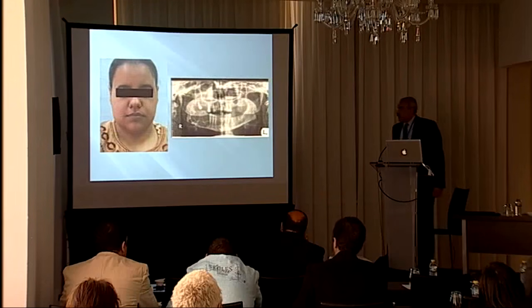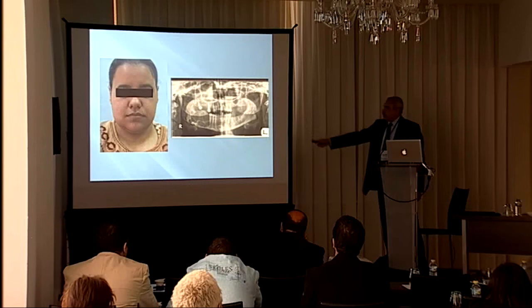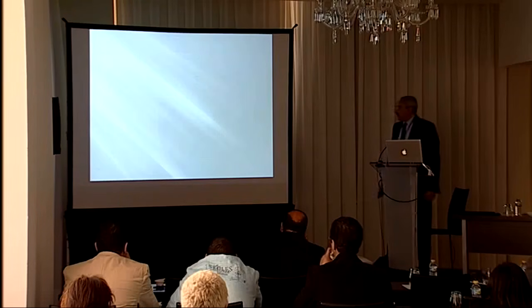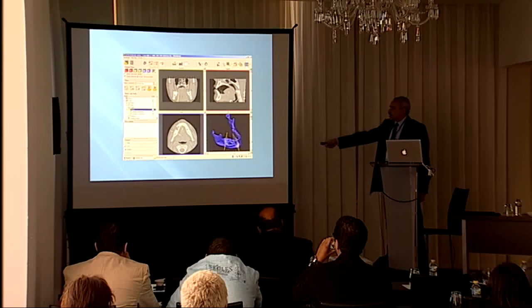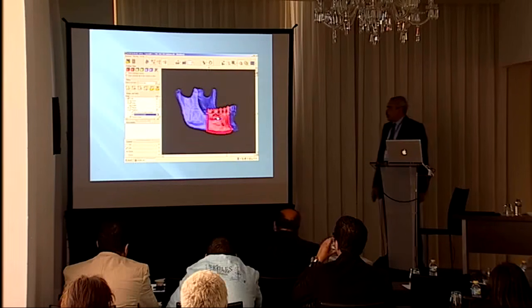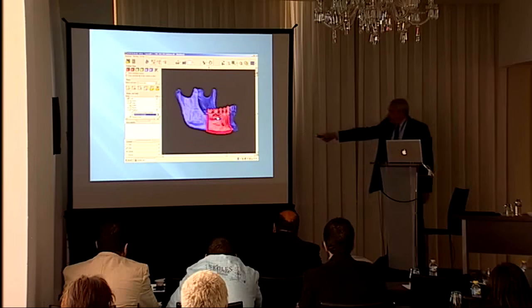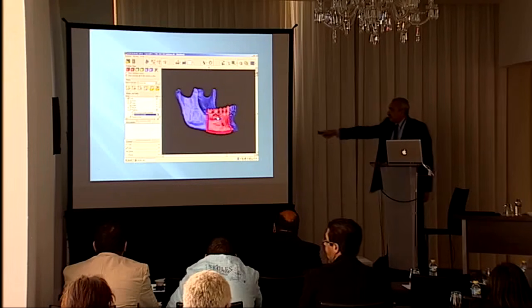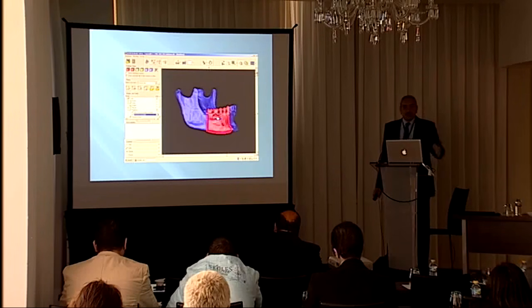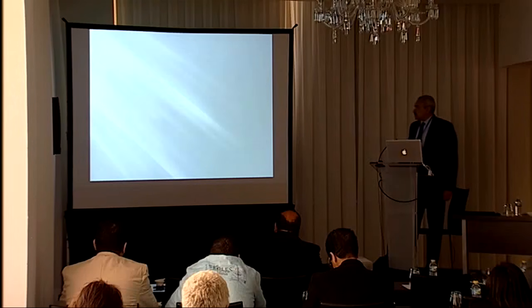What we do now is, we have a lesion occupying the whole body and ramus of the mandible, do the necessary segmentation as we've been through, then we do the resection planes. We define where to do the resection from where to there, and then we segment the area to be resected, and we fabricate a resection template. This would fit on the mandible exactly to show us from where to cut the anterior and posterior cuts.